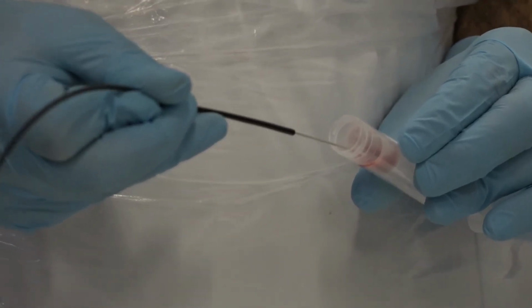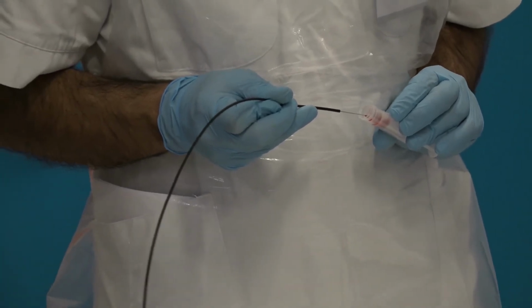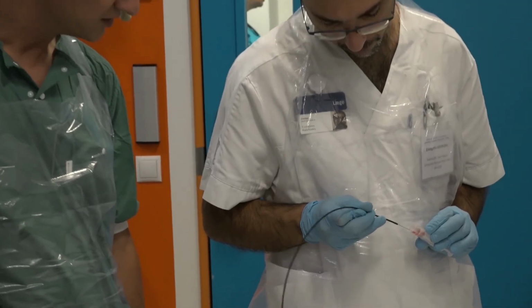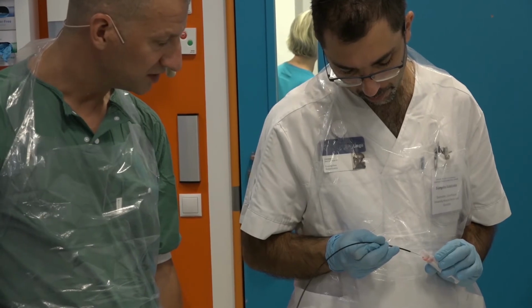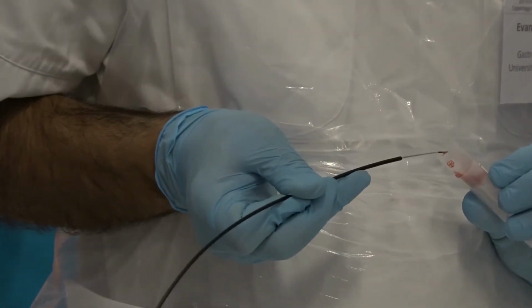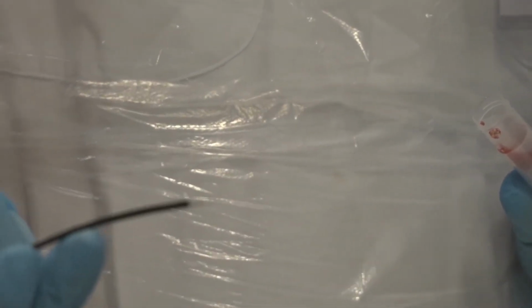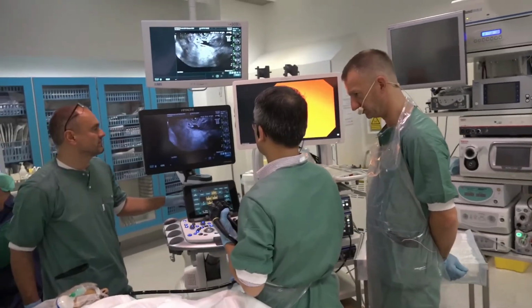Finished? No. So, okay, it doesn't want to go all the way now. Now something is starting to come. I don't know if you can appreciate what's coming. Now we can see it. So far it looks like we are getting mainly blood. That's all. So this was the last Cook. From some of the previous ones, we did see some more biopsy. Yep.